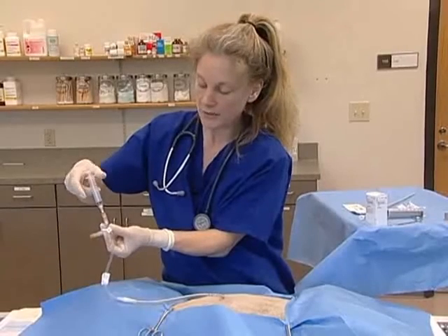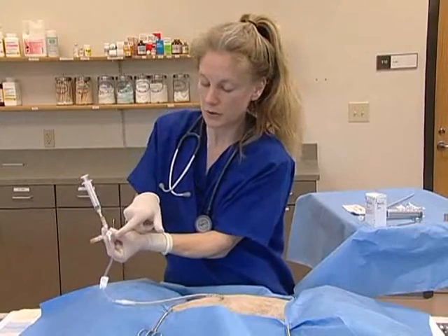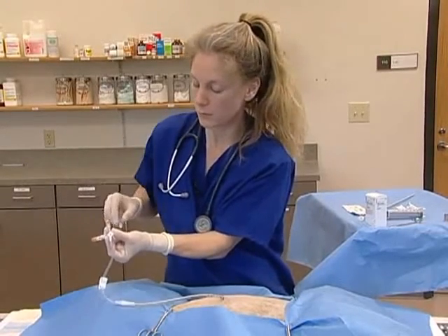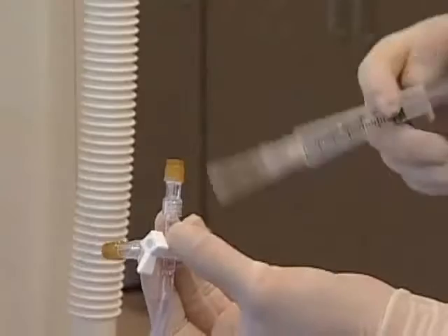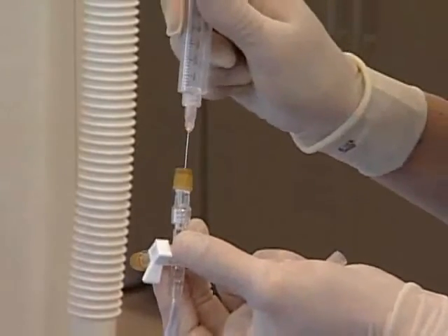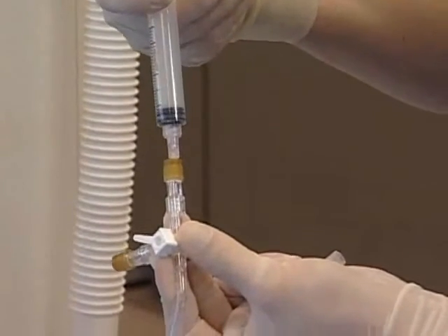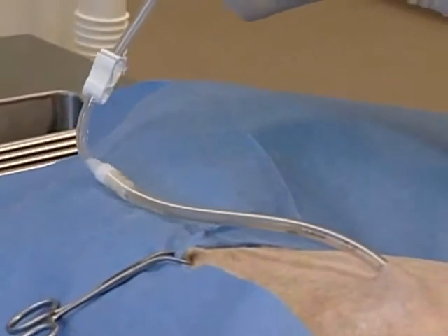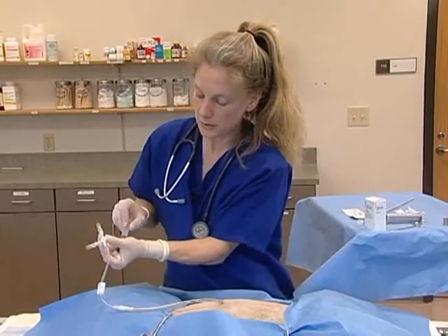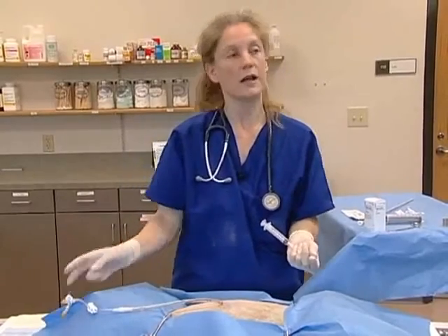What often happens is that the volume is too low to actually get to the pleural surface. In that case, turn the adapter off to the patient, remove your needle and syringe, and insert air into your syringe. Re-insert that into your adapter and chase that volume of fluid with an air chaser in order to let the fluid get to the pleural surface. Turn the three-way stopcock off to the patient, clamp it again, and that should help to provide local analgesia in addition to whatever systemic analgesia you're providing for your patient.